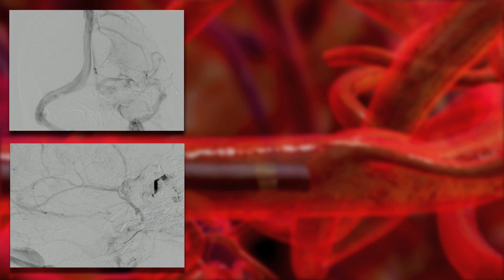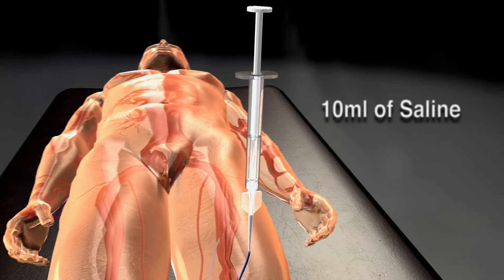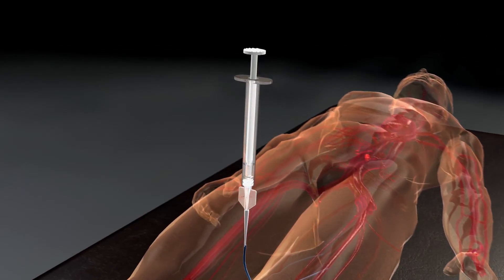Establish a reference image revealing the distal catheter shaft, nidal angioarchitecture, and venous outflow. Flush the contrast from the microcatheter with 10 milliliters of saline to expel the contrast media. Leave the syringe connected to the catheter.